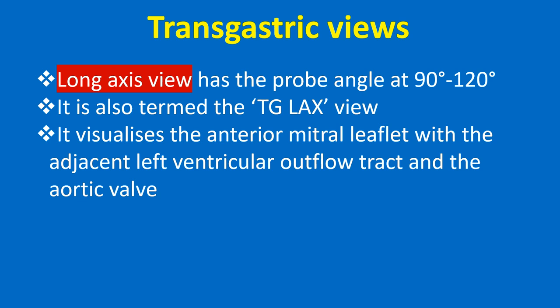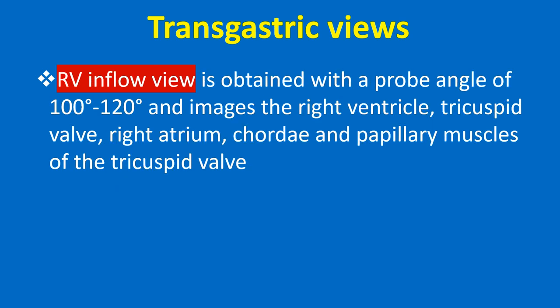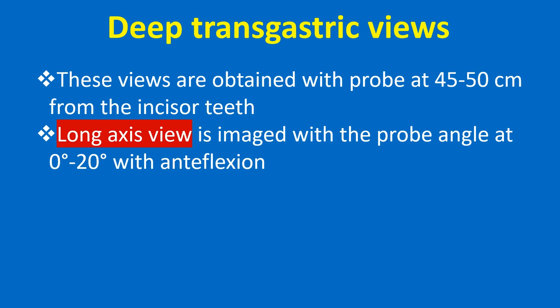The long axis view has the probe angle at 90-120 degrees, also termed the TG LAX view. It visualizes the anterior mitral leaflet with the adjacent left ventricular outflow tract and aortic valve. The RV inflow view is obtained with a probe angle of 100-120 degrees and images the right ventricle, tricuspid valve, right atrium, chordae, and papillary muscles of the tricuspid valve.